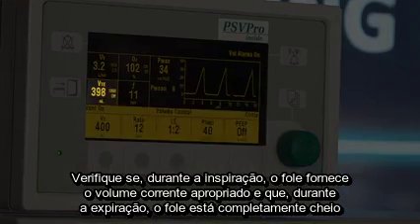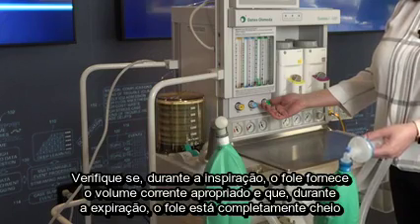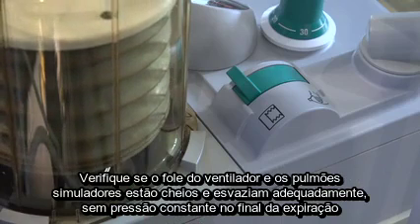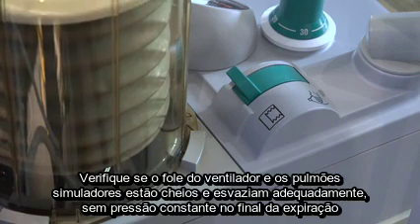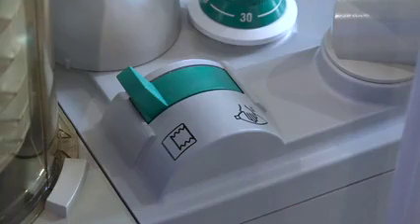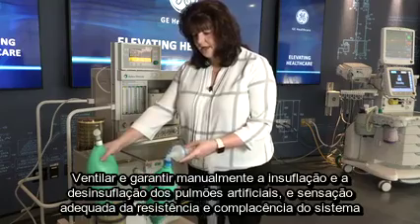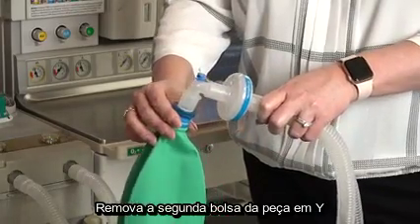Verify that during inspiration the bellows delivers appropriate tidal volume and that during expiration the bellows fills completely. Set your fresh gas flow to about 5 L per minute. Verify that the ventilator bellows and simulated lungs fill and empty appropriately without sustained pressure at end expiration. Check for proper action of the unidirectional valves. Move the bag-to-vent switch to bag mode. Ventilate manually and assure inflation and deflation of the artificial lungs and appropriate feel of system resistance and compliance. Remove the second breathing bag from the Y piece.